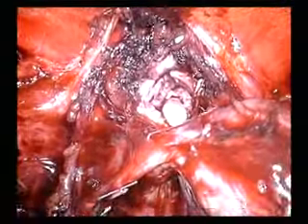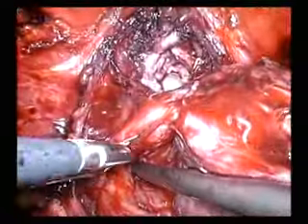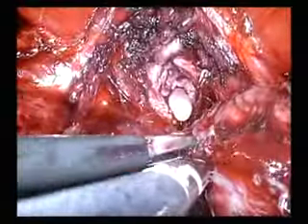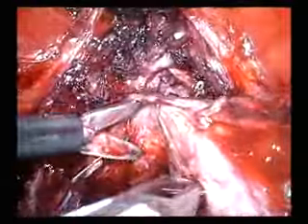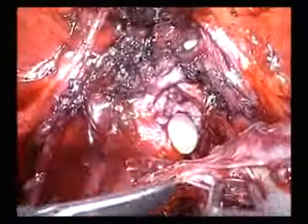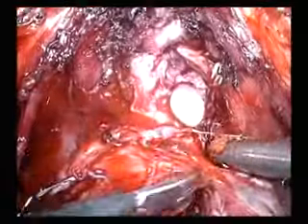The final detachment of the posterior urethra is performed dorsolaterally to avoid any injury to the neurovascular bundles and the rectum. The assistant retracts the seminal vesicle contralaterally out of the pelvis and also pushes the prostate dorsolaterally. Then the dissection is performed as a mixture of blunt and sharp dissection using the scissors.